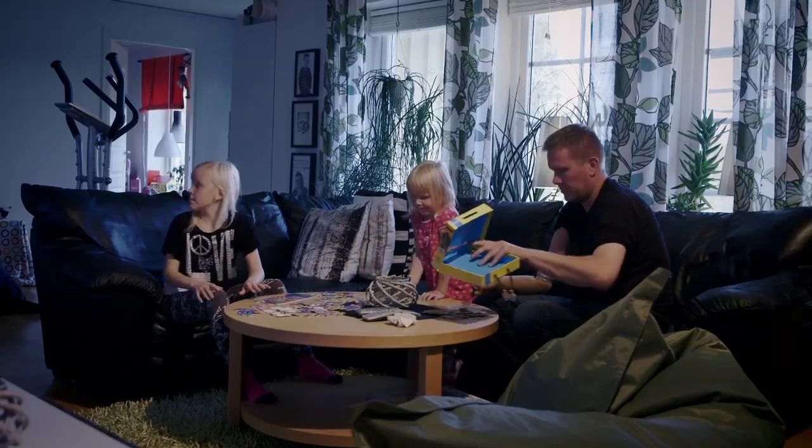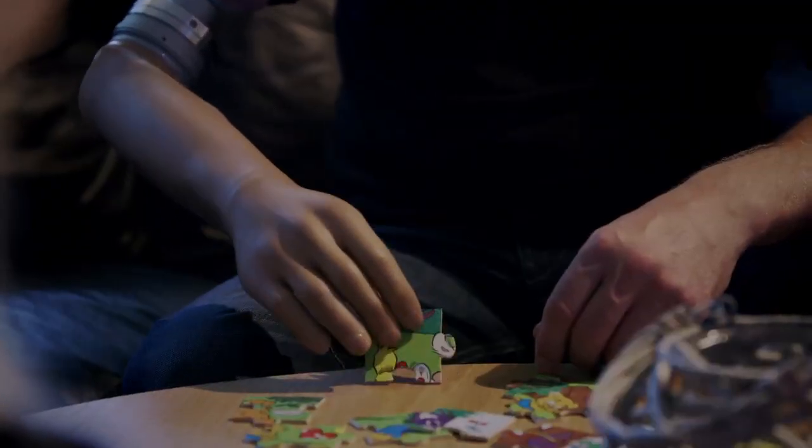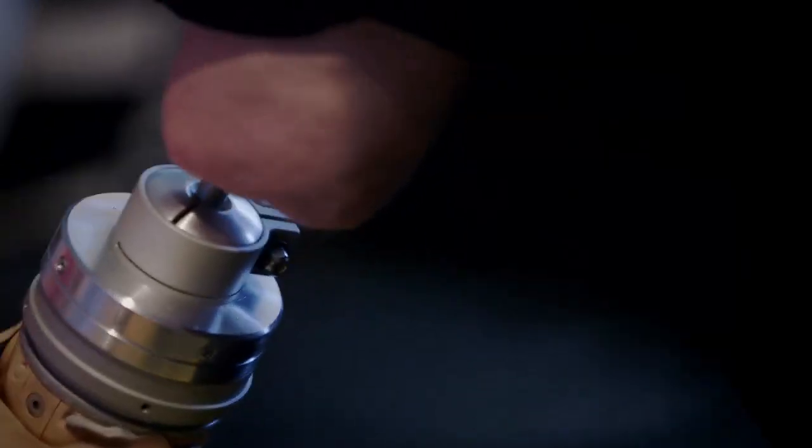With his prosthetic hand, Magnus controls movements with signals from his brain. If he wants to pick up a jigsaw piece, the hand responds.